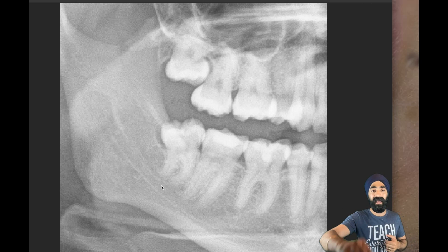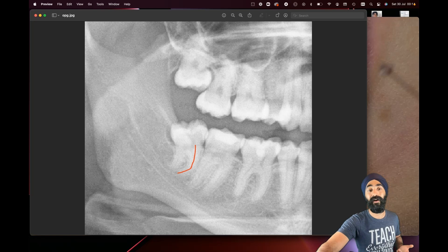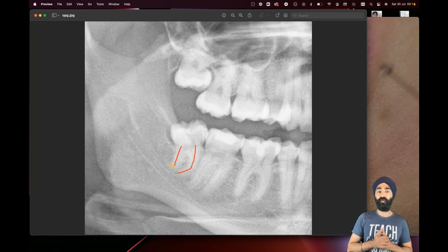The curve is what worries me the most. We know disto-angular is difficult, but when there are curves that could increase our complexity. There's that curvy root. I thought the distal root was going one way — actually I was wrong. What it actually turned out to be is there's a little J-hook on that wisdom tooth, which proved a little bit difficult, but we managed it.